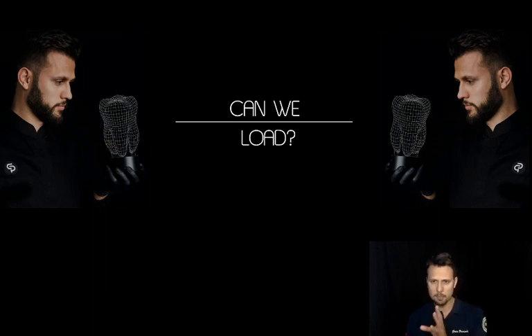Because when we place the implant, we have the torque. There are some data that give us a reference if we can load or not. But when the implant is healed, this reference is off. So we need another kind of data.